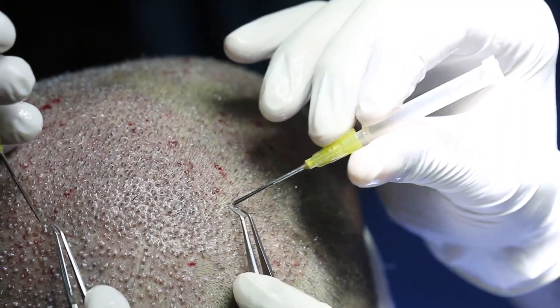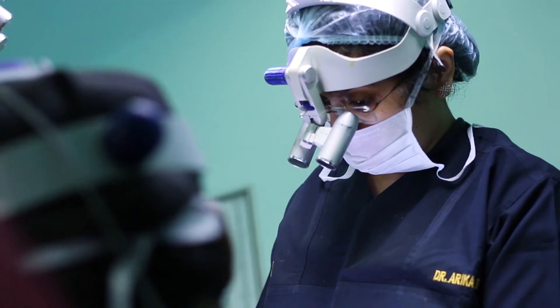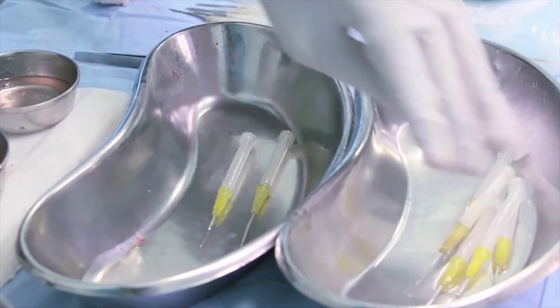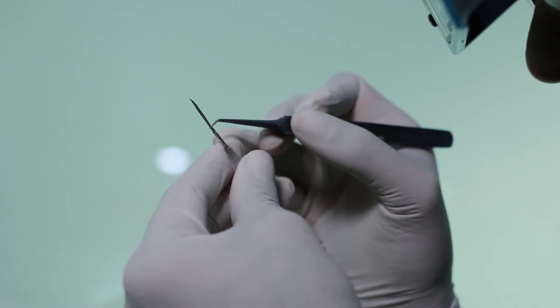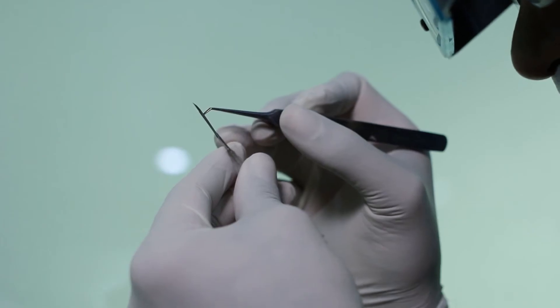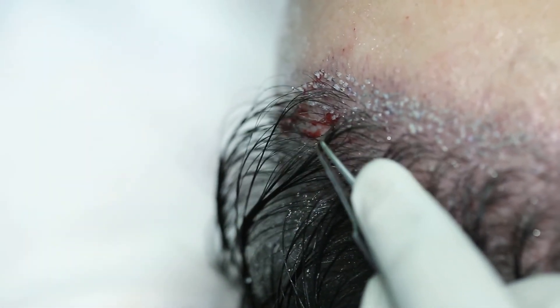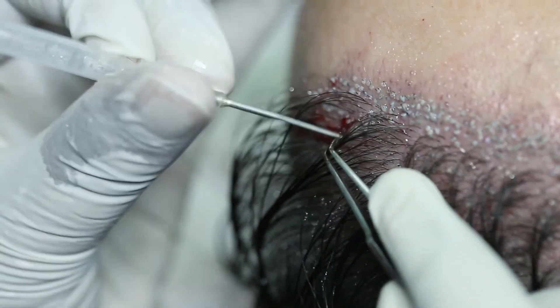The chances of graft damage by desiccation or mechanical trauma are least. Using implanters in DHT, the grafts are held from the hair level and loaded into the implanters, which then unload the graft into the sites. So there is no root touch in this process.